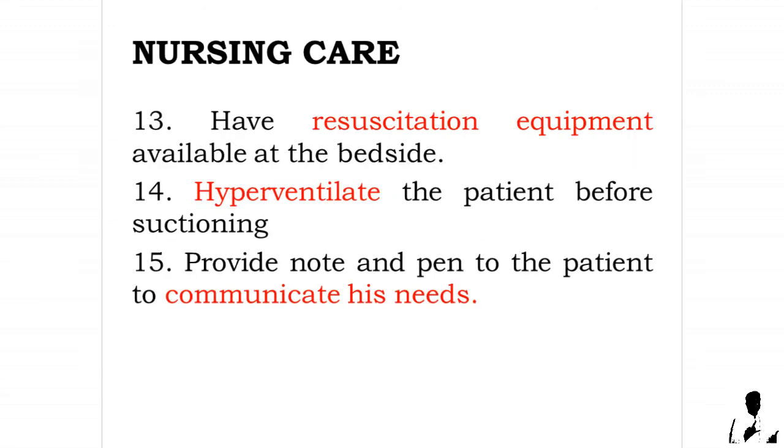13. Have resuscitation equipment available at the bedside. 14. Hyperventilate the patient before suctioning. And lastly, provide note and pen to the patient to communicate his needs.